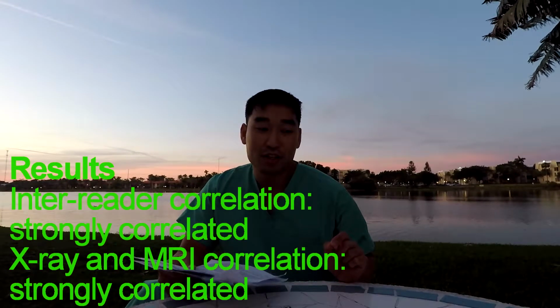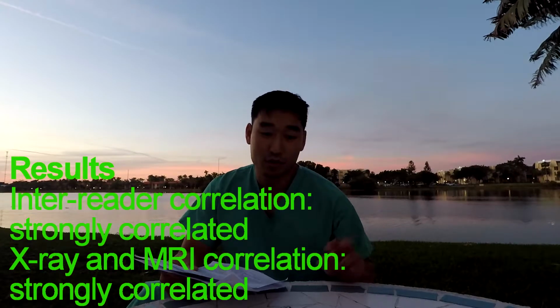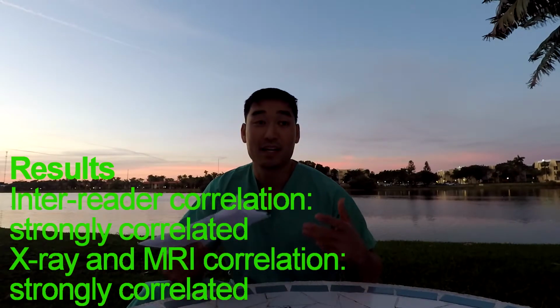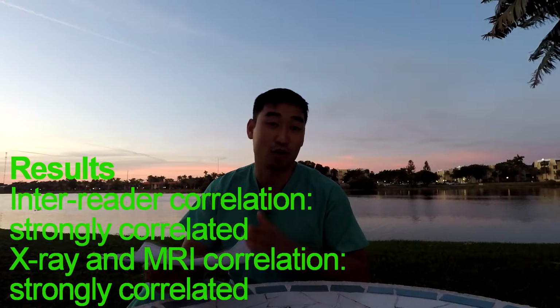After they calculated all the angles and averaged them, what they found was, first of all, the inter-reader reliability is strongly correlated, meaning that the 2 readers reading the film of the X-ray and the MRI read them relatively in a similar fashion. So they're basically reading like robots in a way.